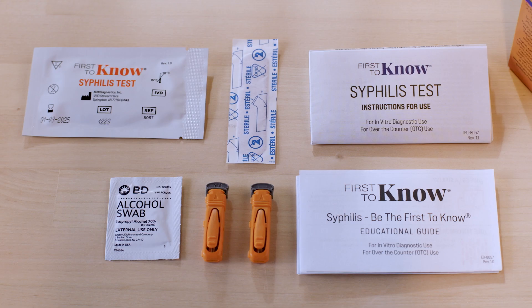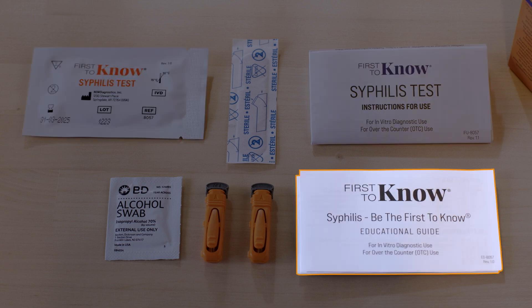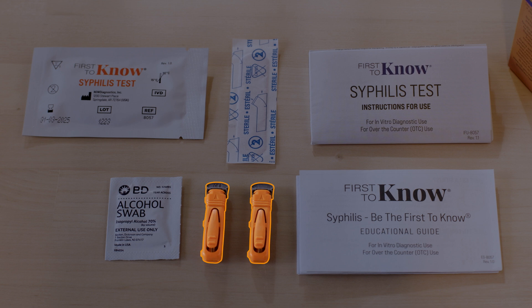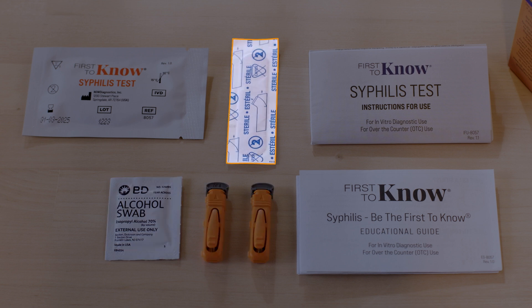Before you start, lay out everything you need for the test. In your kit, you'll find the following: one sealed aluminum pouch containing one First to Know Syphilis Test, one instructions for use, one educational guide, two disposable single-use sterile lancets, one alcohol swab, and one bandage.